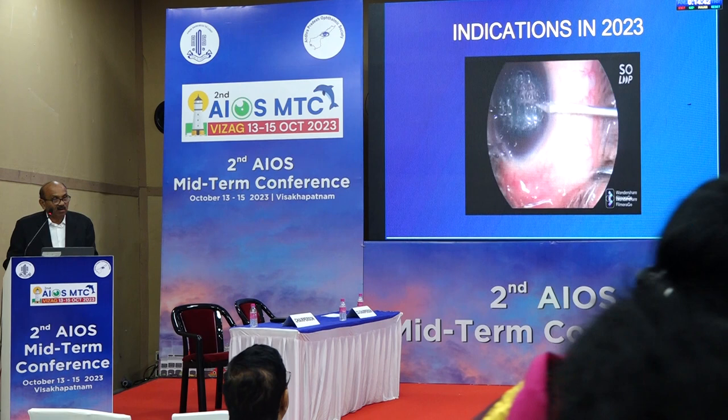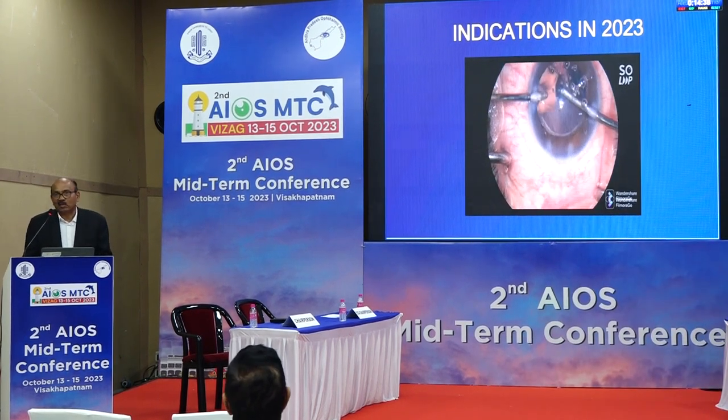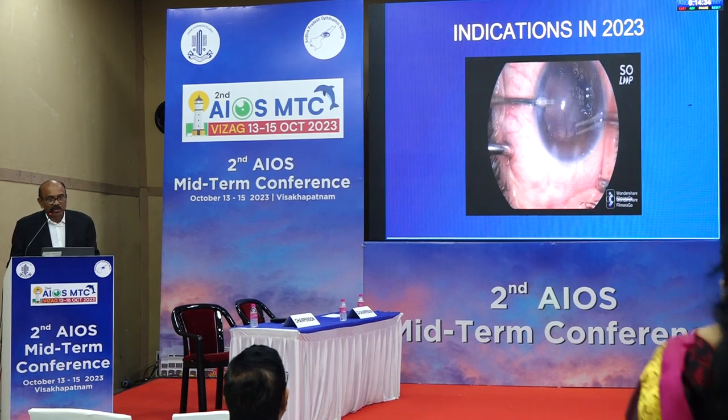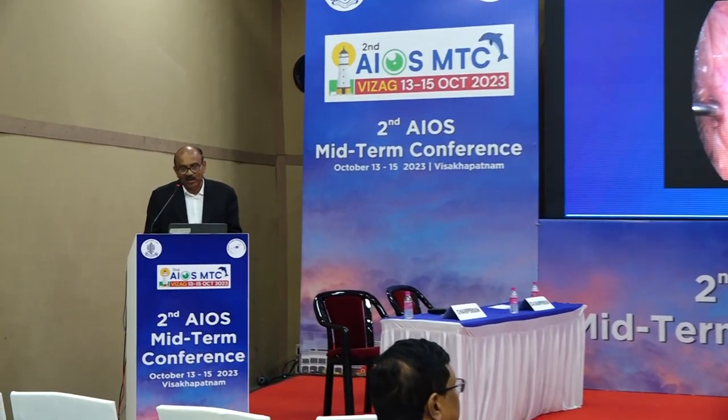This is a case of femtocataract. I'm also a femtocataract surgeon, where the nucleus is made soft, the entire thing is aspirated, and we inject the lens at the end. Why I am showing this video is, as a small incision surgeon, keep this in mind while doing the surgery: I should compete with this fellow.